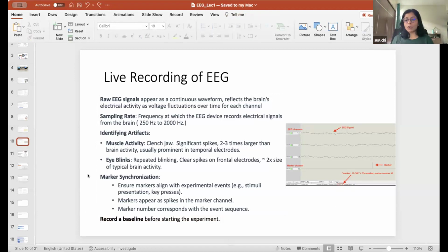But don't do it too long either. Otherwise, people will fall asleep in the resting state, and then they will not be paying attention. Sometimes people record the baseline equal to the intervention timing, and then they are using that baseline as an active control. In your case, you already have a control, because in one of the studies recently published by AIMS Delhi on Yog Nidra, they had 20 participants.